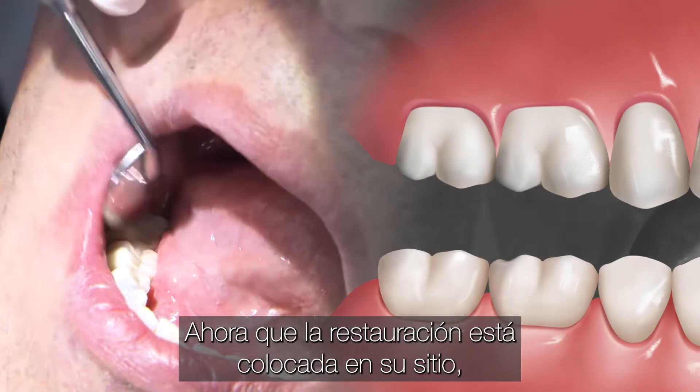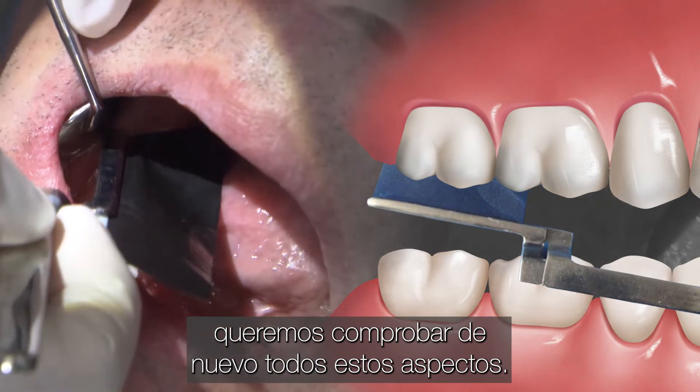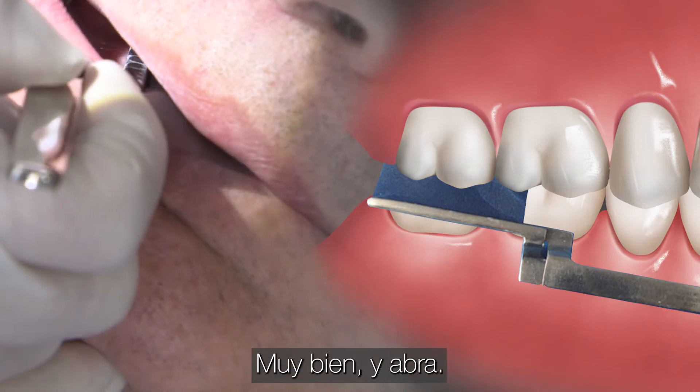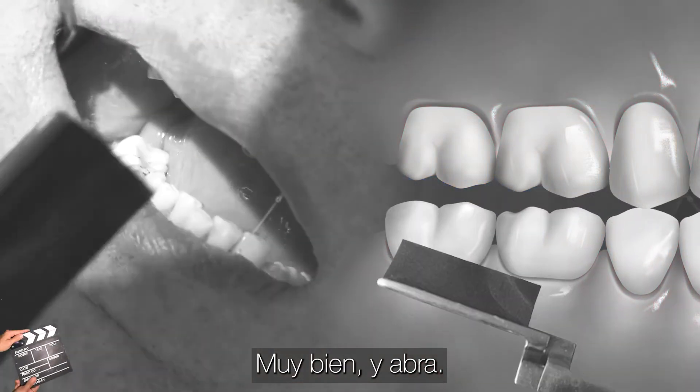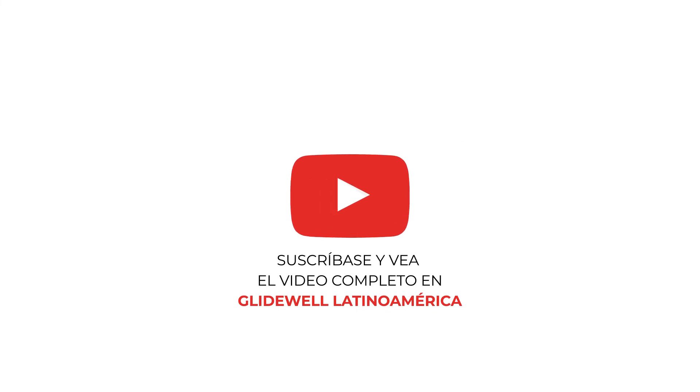Now that the restoration is secured into place, we do want to check all these aspects again. Go ahead and bite down together, tap, tap, and bite hard together. All right, and open.